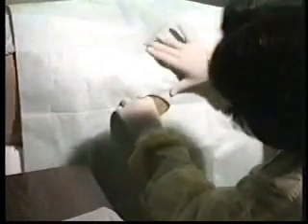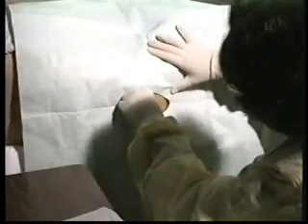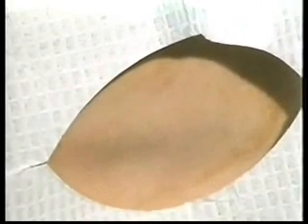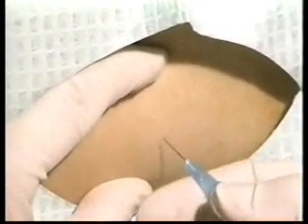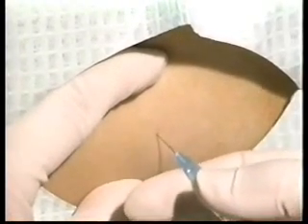Drape the field. I'm going to start numbing your back. Some patients say this feels like a bee sting or just a little bit worse. This stinging pain is caused by stretching the underlying tissue. However, by stretching the skin before injection, you stimulate the skin's sensory receptors, so numbing will seem less painful.